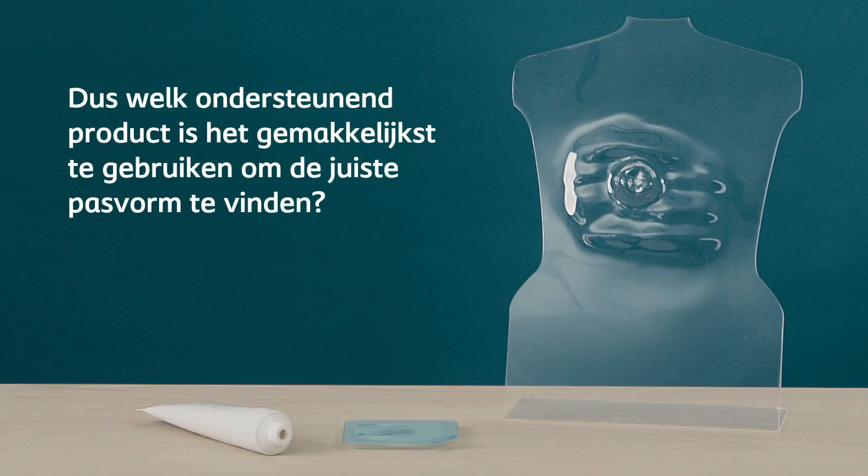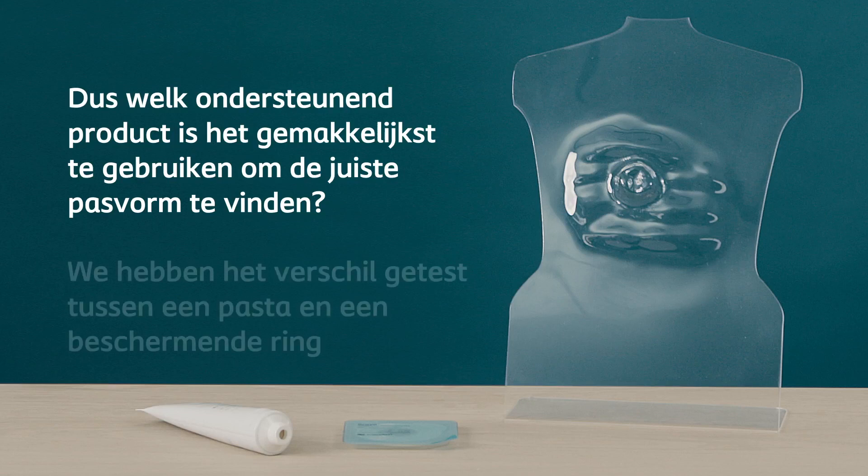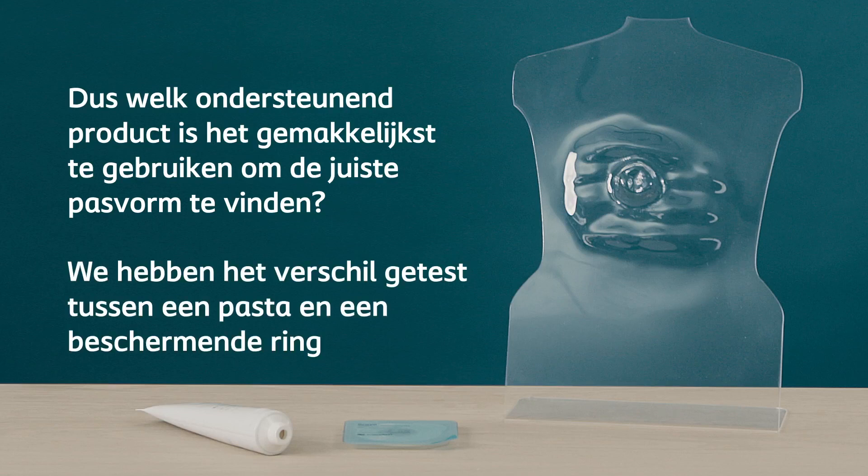So, which supporting product is the easiest to use to find the right fit? We tested the difference between a paste and a seal.